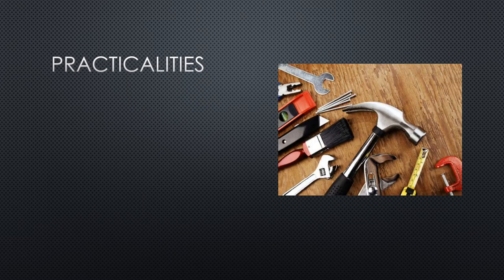Okay, let's talk about some practicalities of how to use ultrasound during a cardiac arrest. And the first question is when to use it. Some advanced paramedics will actually perform this scan in the pre-hospital setting. But as an emergency physician, I think our choice is whether to perform it right at the beginning at the first rhythm pulse check or at the second rhythm pulse check.